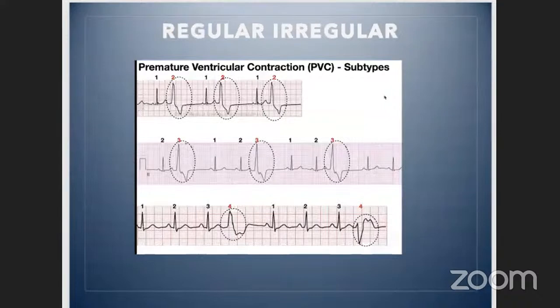Okay, perhaps what we're less familiar with is the regularly irregular. Here we can see a paired beat. If you were to feel the pulse of the patient, we would say that it's irregular, but it is regularly irregular. Oftentimes we just think of regular versus irregularly irregular, and we don't really know that there are a wide variety of causes or differential diagnoses for everything in between. For regularly irregular rhythms, we do have additional examples, and there were some in the case studies as well.